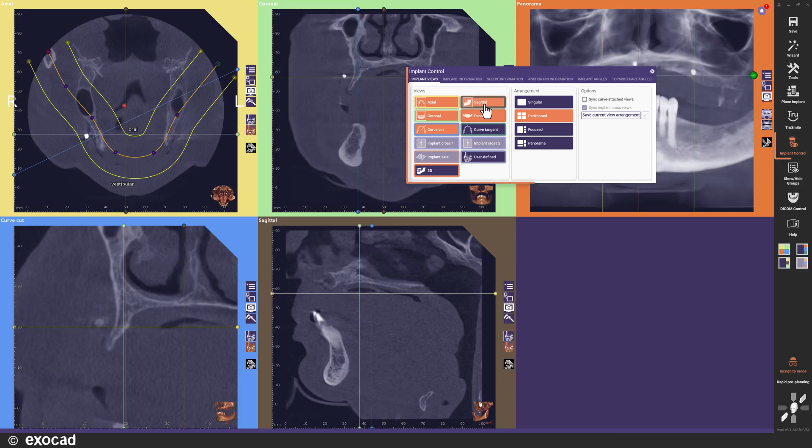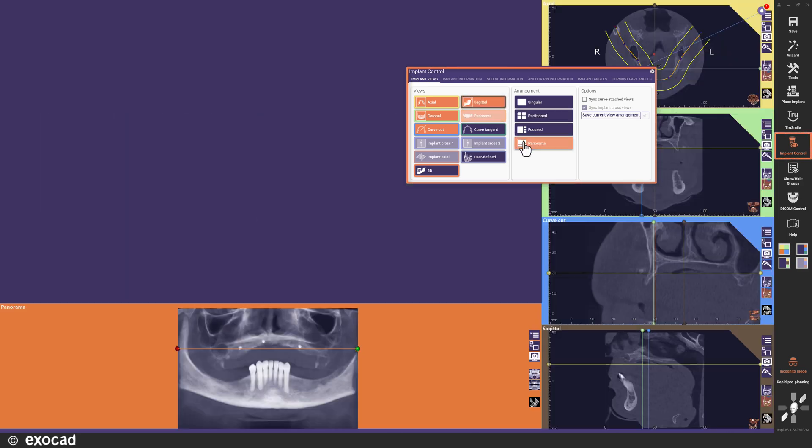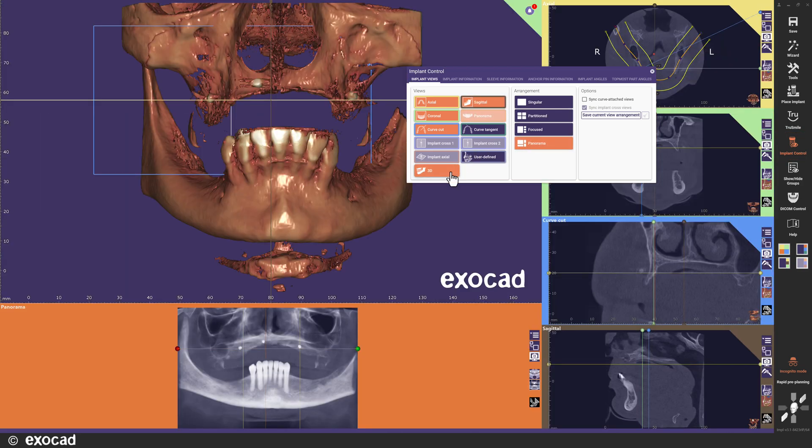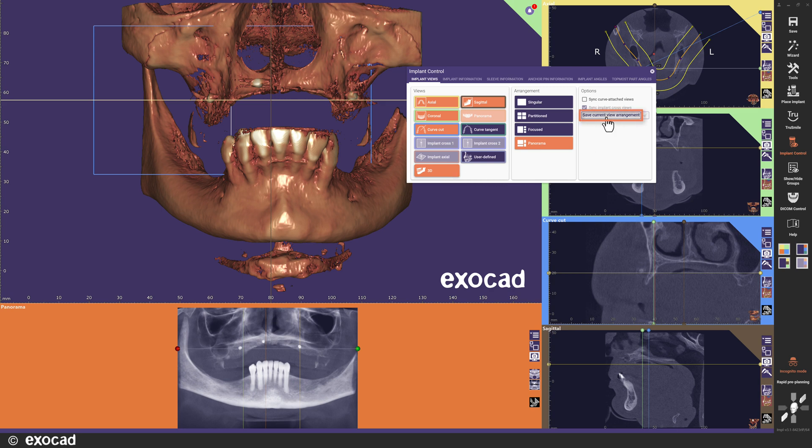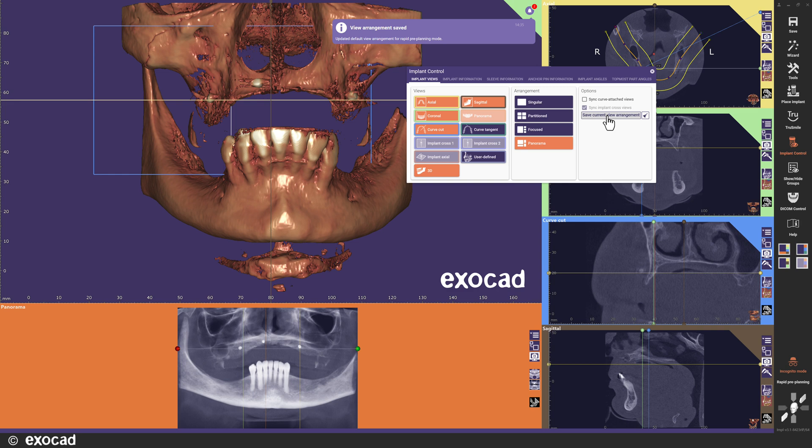Simply open the implant control, select which views you want and in which arrangement you want them. Then click the Save button. The next time you open the step, it will open with your preferred view arrangement. You can save different arrangements for each workflow step. To delete your saved view arrangements, click the Brush button.